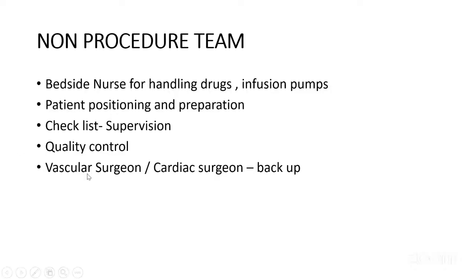Quality control and vascular surgeon or cardiac surgeon backup. Sometimes the patient may have some complication, for example small vessels, a trauma, or a rupture of the artery, and there can be significant hemodynamic instability because of the blood loss. In that scenario, we need to have a vascular surgeon or a cardiac surgeon backup. We had one patient who had a very small femoral artery. While cannulating, there was an injury to the femoral artery, and then we had to convert the percutaneous cannulation procedure to a surgical, open cannulation.